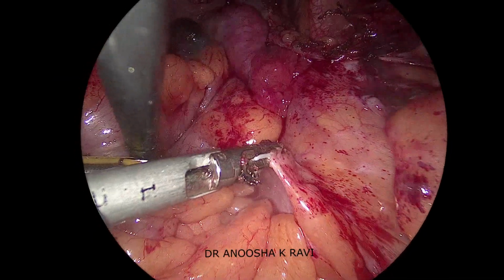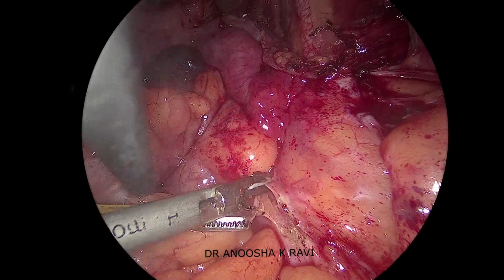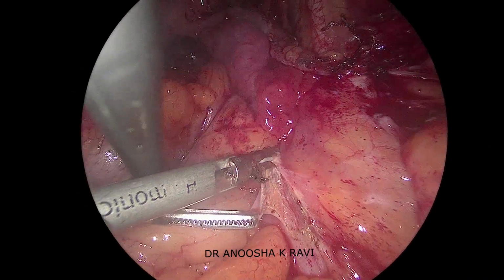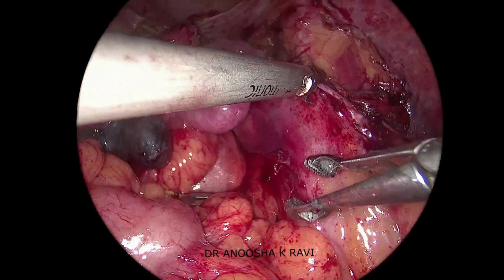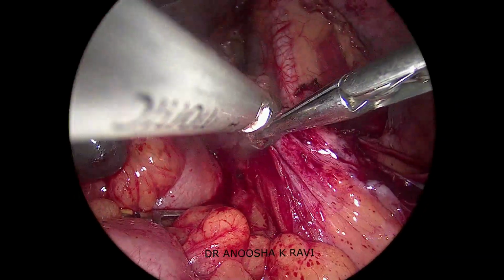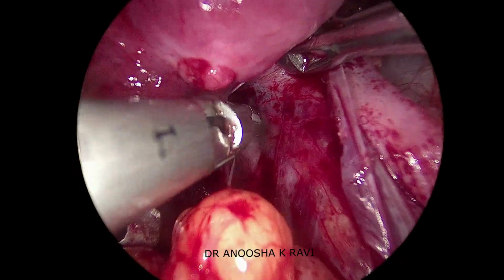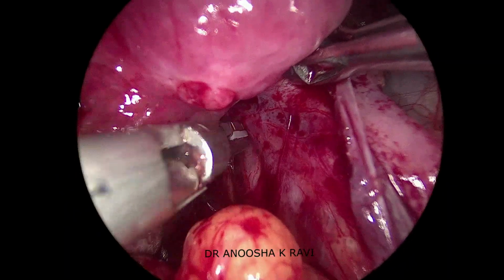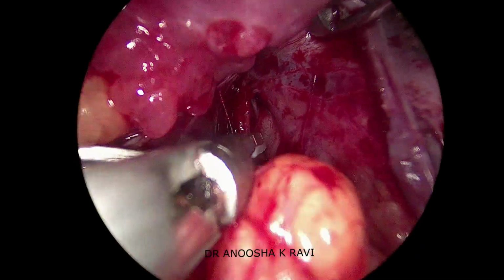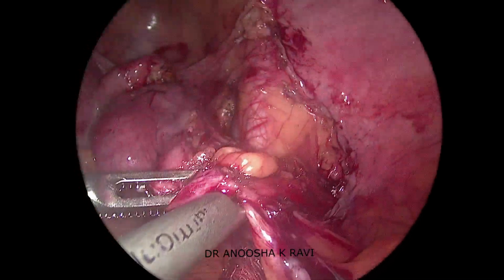Next is dissection in the lateral pararectal space to do ureterolysis. The peritoneum is lifted, ureter is identified by its peristalsis, and with blunt and sharp dissection, ureterolysis is begun. With ureter in the view, right infundibulopelvic ligament is isolated, coagulated, and cut.